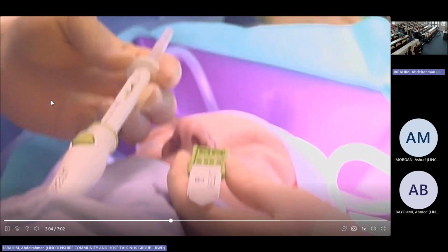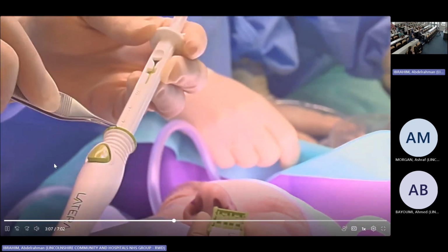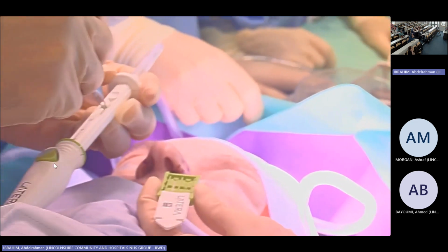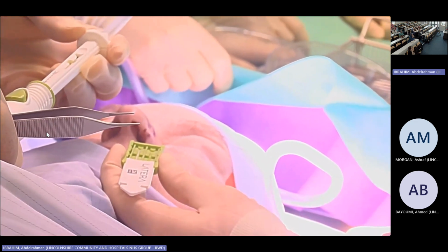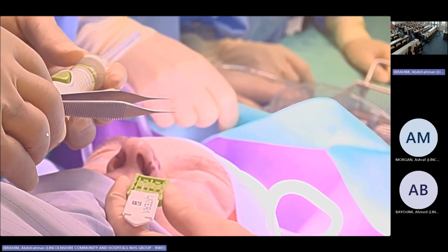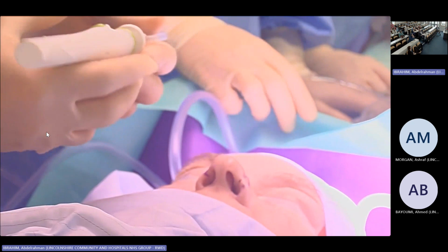So simply you're going to pick up one of those implants, okay? One of those, okay? And just put it here. And simply to open it, at the back of this introducer there is a button to open the introducer. Once you put it in, put it back, and there are 2 clicks. The first click is just to make sure that your implant is now in the needle, and the second one is when you release it in.